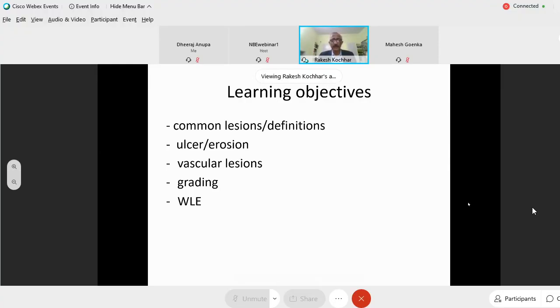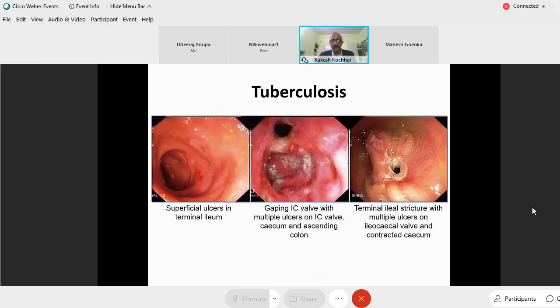curriculum. And why I have restricted to white light endoscopy is because that is the conventional way we continue to do endoscopy. And in India, while narrowband imaging is widely available now, still the majority of the people, rather all the people, even at institutes like PGI, we continue to use white light endoscopy for most of the procedures. For selected lesions, we switch over to narrowband imaging.